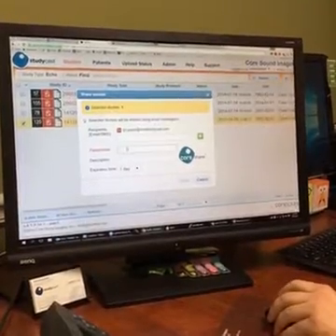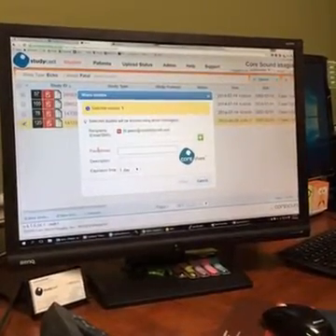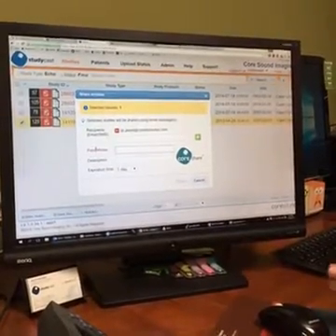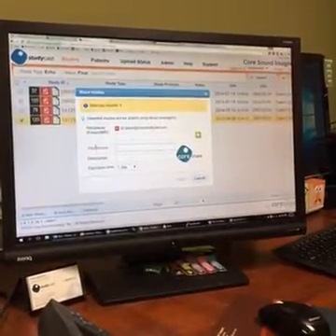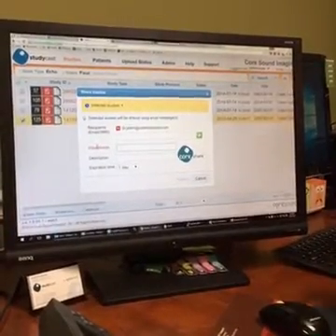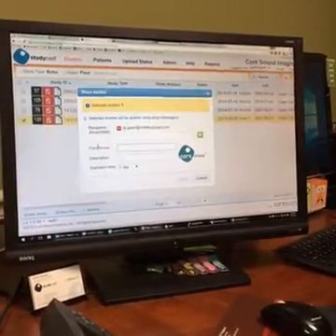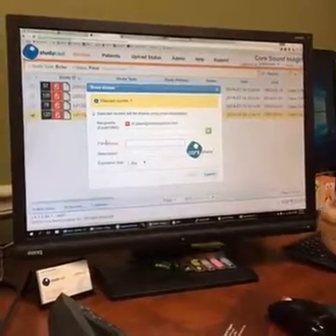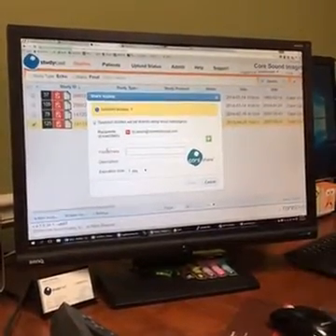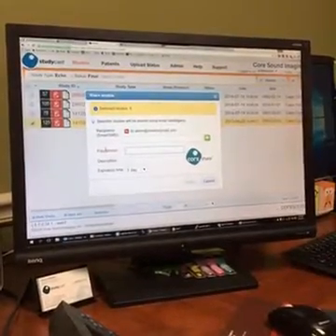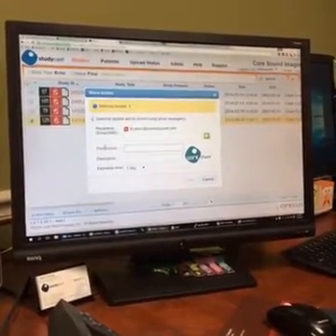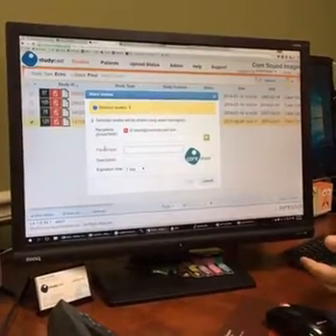Now the passphrase — this field is required, and this is for security reasons. The way that it works is you can set this to anything that you want, and you will have to provide this either in a separate email or a phone call to the recipient, letting them know that they're getting this and what the passphrase is. It's just for security so that when the link is generated, it is password protected.